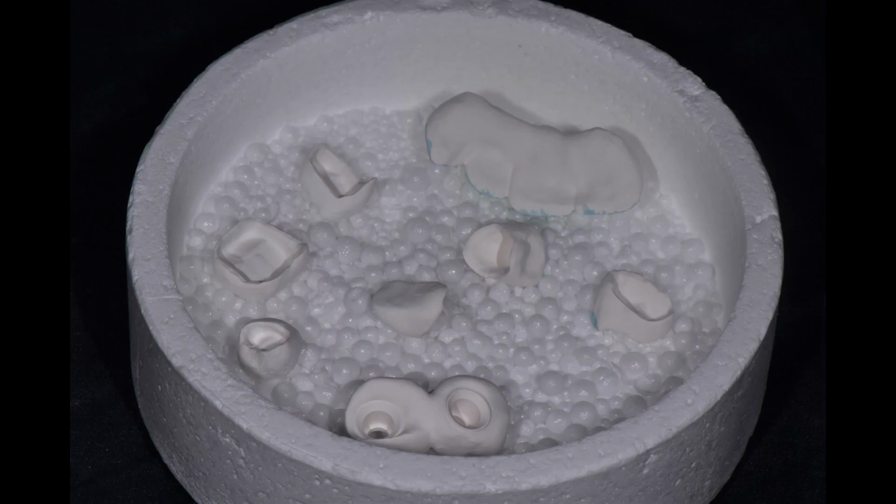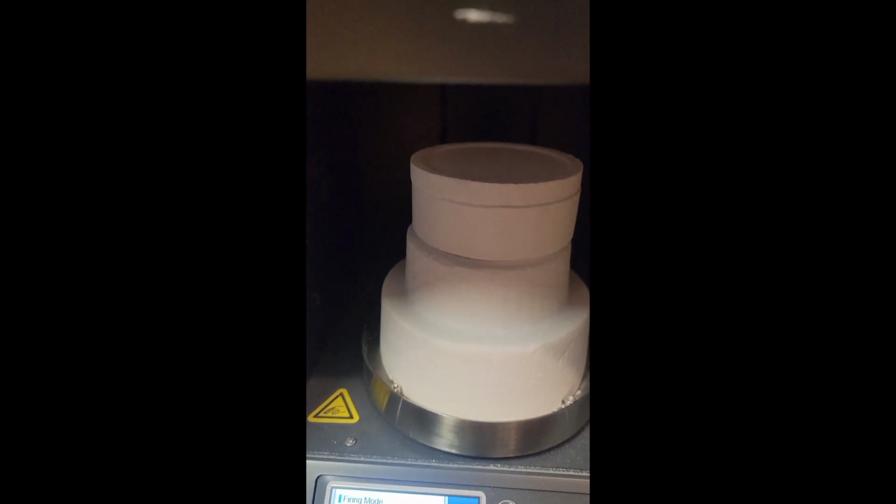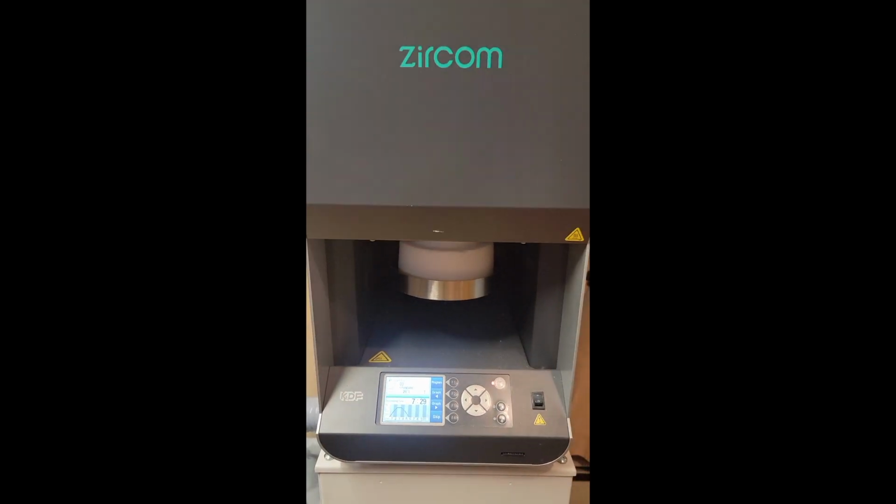There they are in the sintering tray with some other cases. We're going to put them in the furnace overnight at 1500 C for 8 hours, and then they're going to come out ready to install.